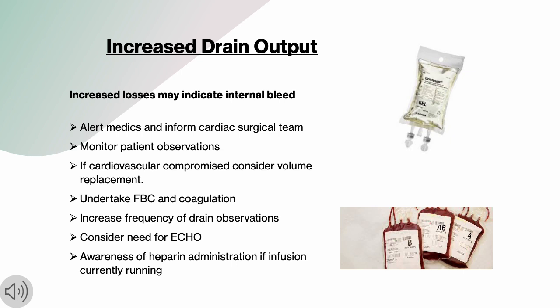Drain observation frequency should be increased as appropriate, and the observation should be made with regards to the contents of the drainage. Is drainage frank blood or is it serous fluid? It should be discussed with medical teams and cardiac teams as to whether patients require a repeat echo to look for accumulation of fluid or blood in the chest cavity.